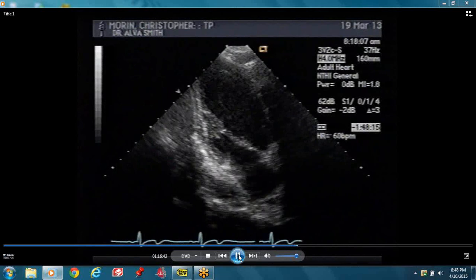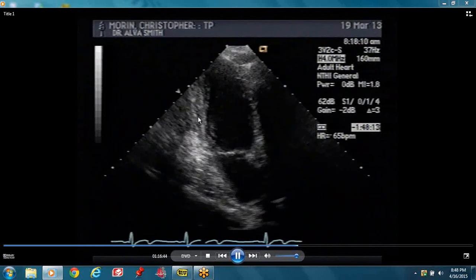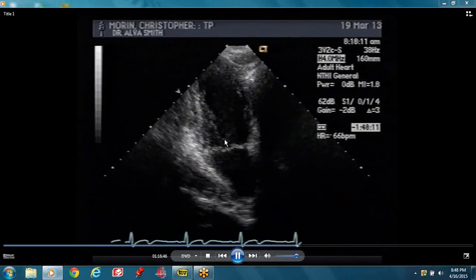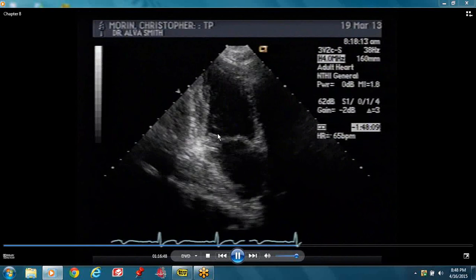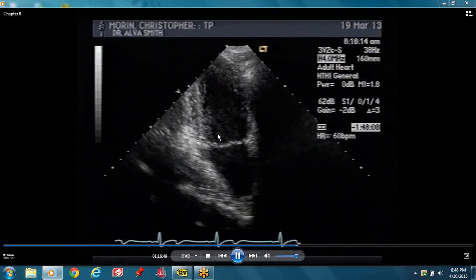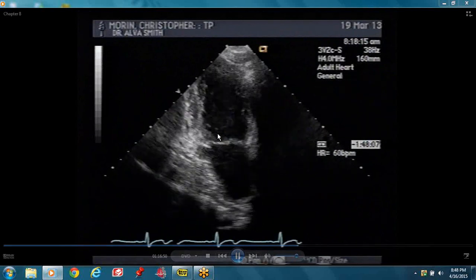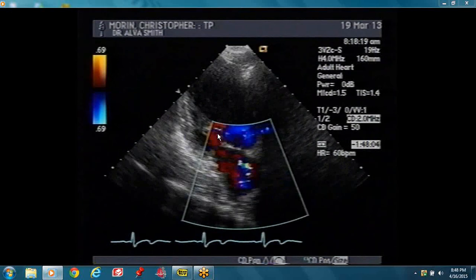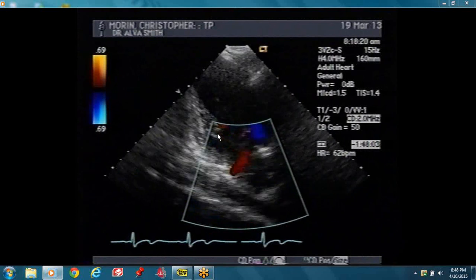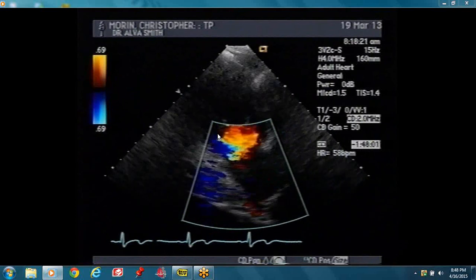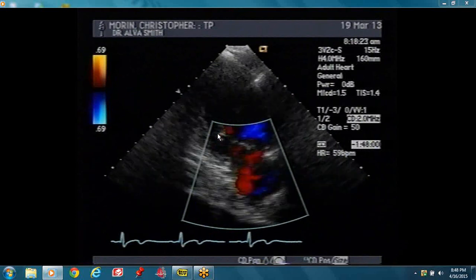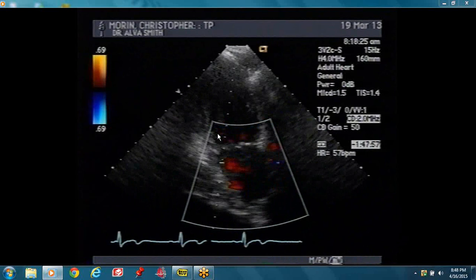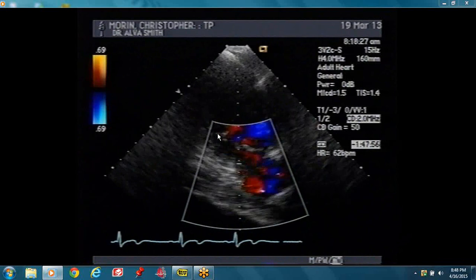That's your two chamber view. You can see a papillary muscle and a cord. You're still looking for thickening with contraction. If you don't see thickening with contraction, then it's either hypokinesis or akinesis.